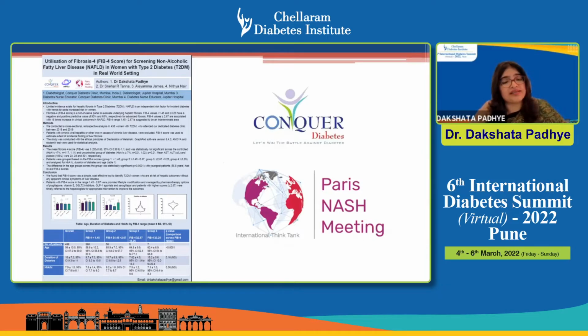Then eventually lifestyle modification and pharmacotherapy were started. These patients were further evaluated by FibroScan, and the monitoring is going on. And in the last 1 or 2 years, we are getting excellent results, reduction in FIB score and reduction in the stiffness index as well.